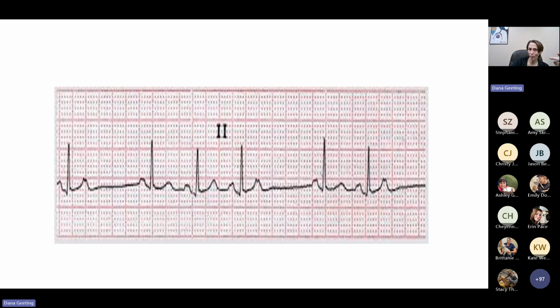So on this one, the P wave is probably hidden. If you look close, the T wave almost looks double tinted. This T wave here has an extra little bump in it. That extra little bump is your P wave, but you're missing something. So it's a bradyarrhythmia. That's a block. We're looking at the rate. It's slower. Correct. And something is being dropped right here.